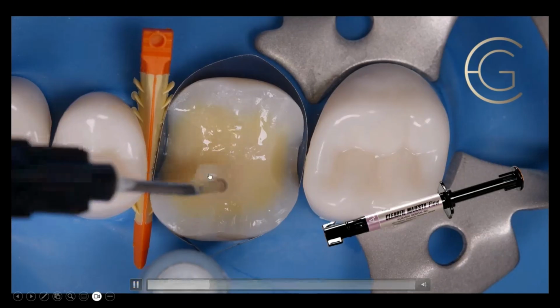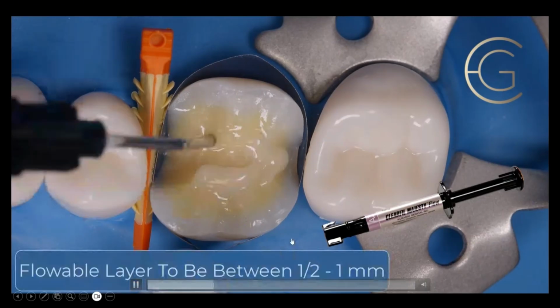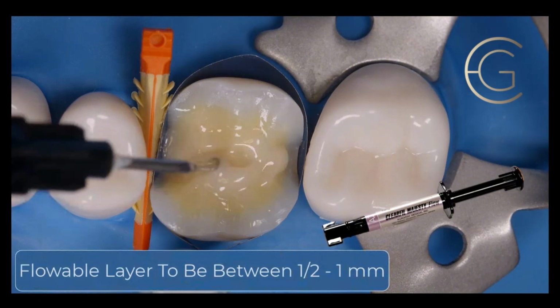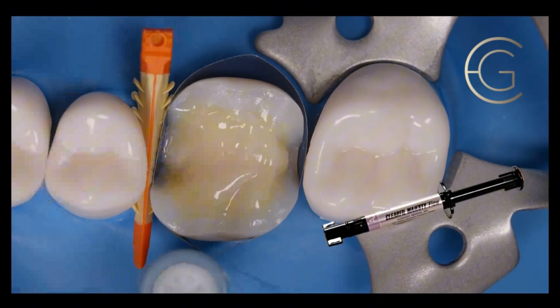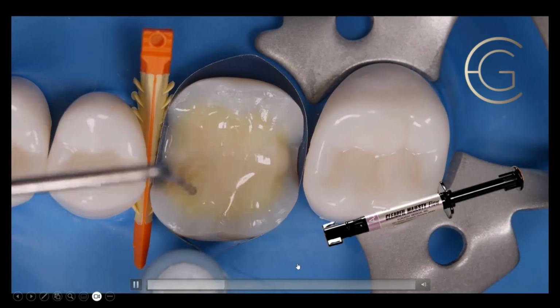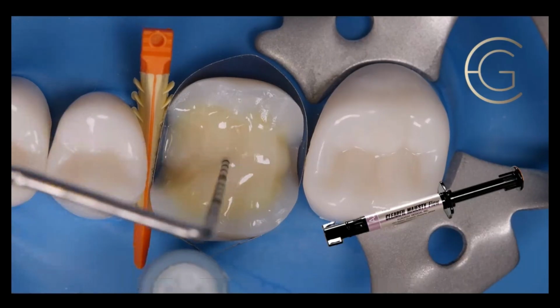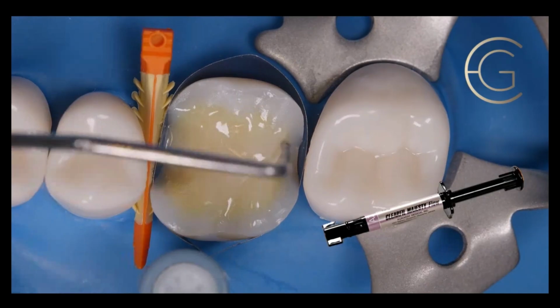So now I'm taking my Majesty Flow. This is my flowable, and because I'm filming this, I'm taking forever. I'm going to push this around, and then I'm going to use a 1 millimeter probe increments to spread this around. And notice I never took my tip out. That prevents the bubbling. Now I'm going to spread this around, make sure I've covered all the dentin. This is the first couple. This is kind of a pucker factor because you've never done it.